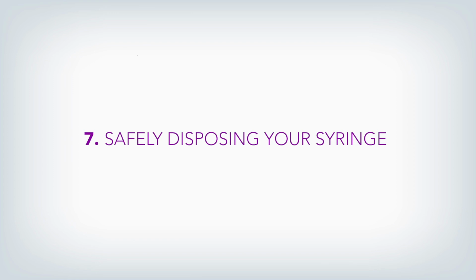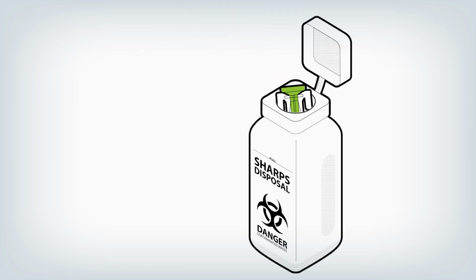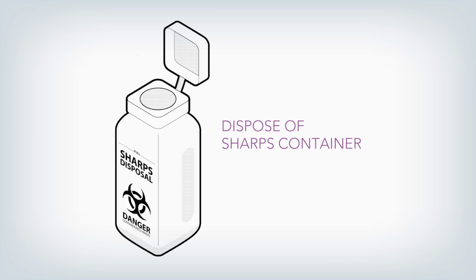Your used pre-filled syringe should be discarded immediately after injection. To do this, put your used pre-filled syringe into your sharps container. Do not try to put the cap back on your syringe. If your injection is given by another person, they should also use and dispose of the pre-filled syringe with care to prevent accidental needle stick injury or infection. For your own safety and for the safety of others, never reuse the pre-filled syringe. Always keep the sharps container out of the reach of children. Make sure you dispose of the sharps container as instructed by your doctor or nurse.